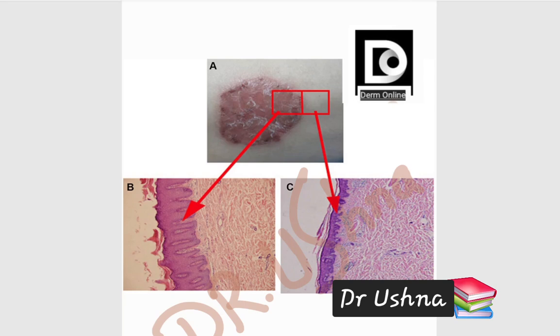So in this session, we are talking about the psoriasis histology. Okay. So whenever we talk about the psoriasis, psoriasis is very, very important for your dermatology exam. Being a PG, you cannot ignore the psoriasis topic. What are the histological features of the psoriasis? This is a normal skin. Remember, this is a normal portion of the skin, and this is something related to your lesion of the skin.